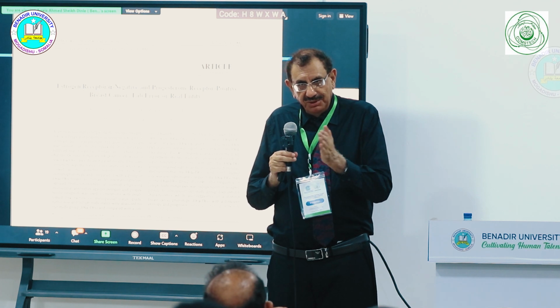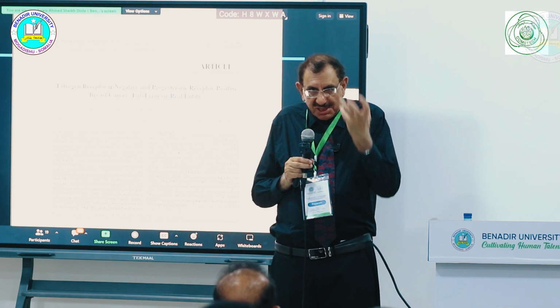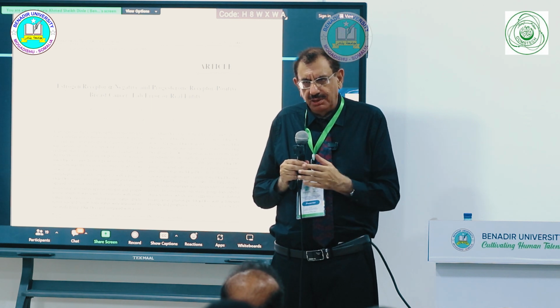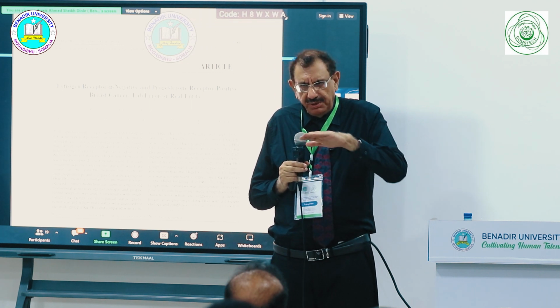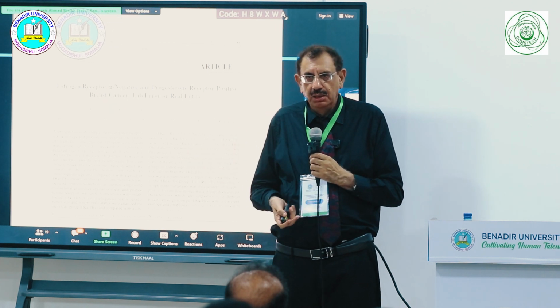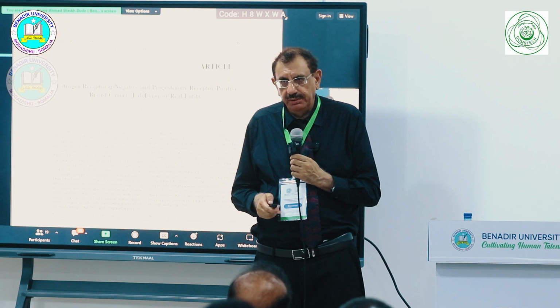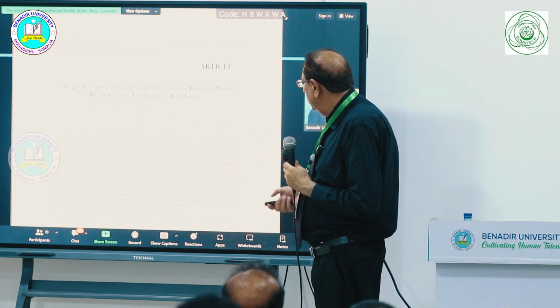So if you do a tumor which is ER positive, PR positive, the PR staining is much brighter than ER staining. So maybe if the estrogen receptor is weakly expressed, it may not come to the detection level. So these patients should get benefit, in other words. You may have about 5% of cases where ER may be negative, PR positive. They shall also get, and must not be deprived of, the hormone therapy.